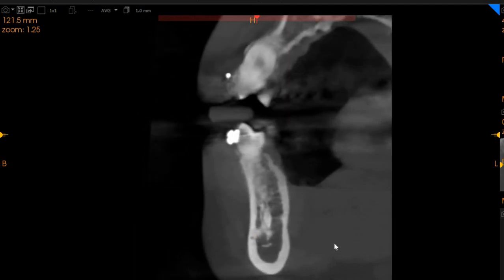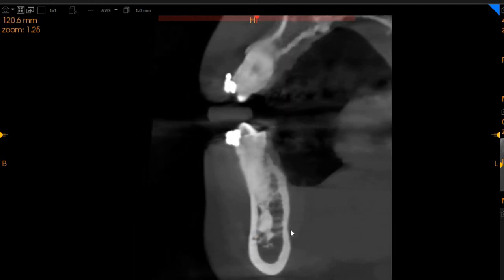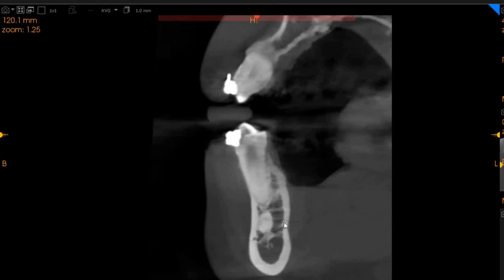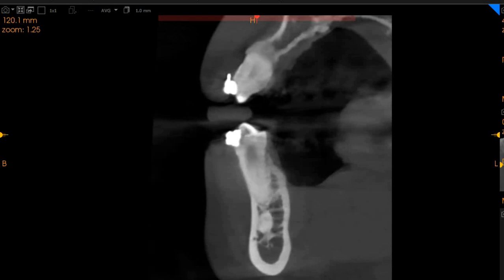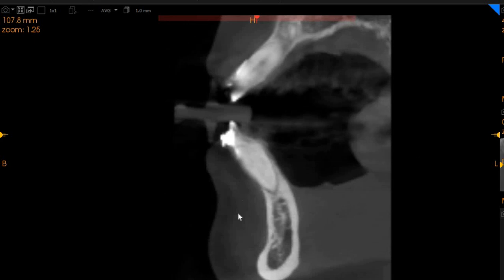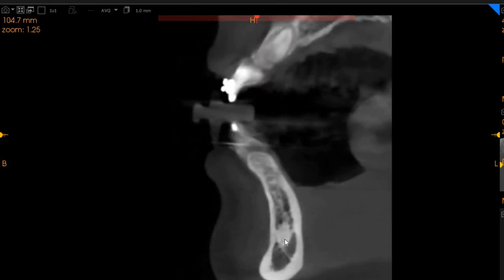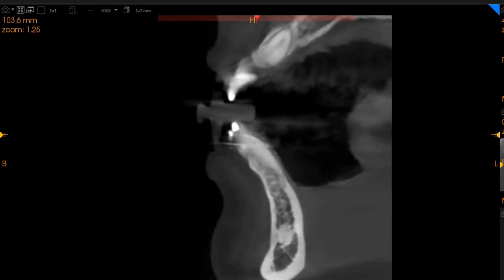Moving to another point here, again we see an area — there we go — we can see a PDL here, so it could be cemento-condensing osteitis or idiopathic osteosclerosis. Moving further down, we see another point here which is just an isolated idiopathic osteosclerotic lesion.